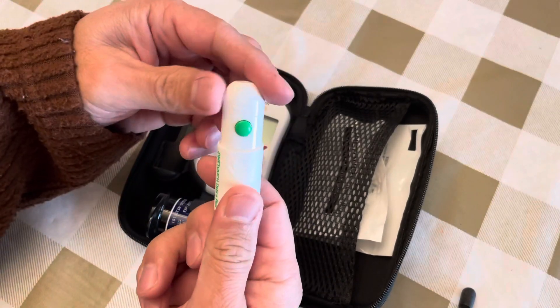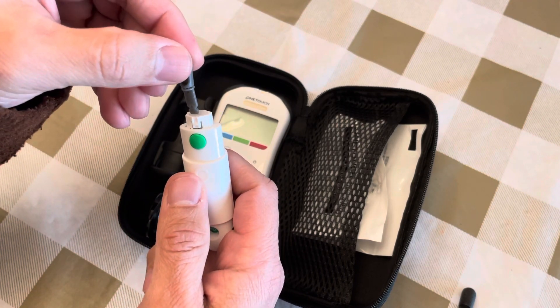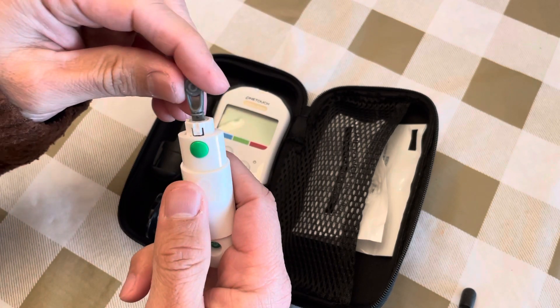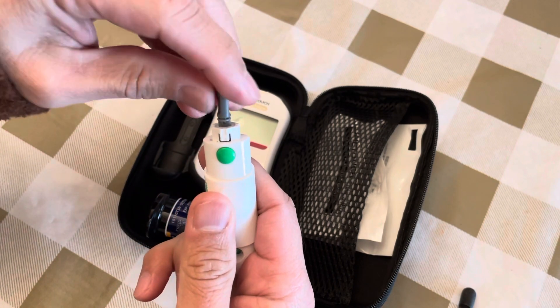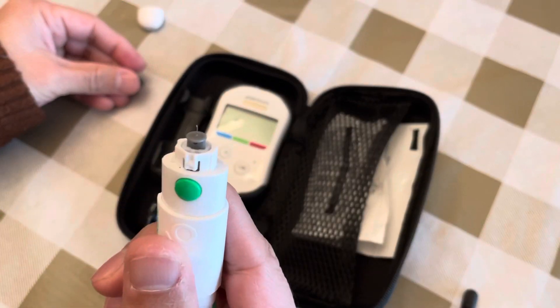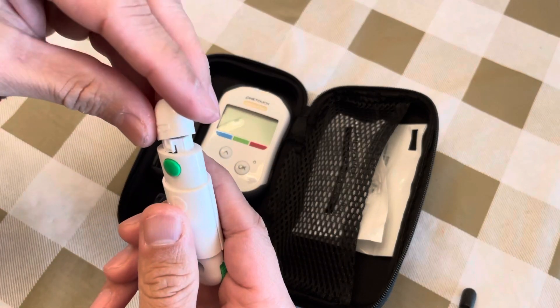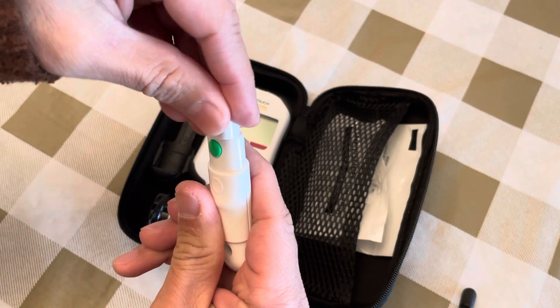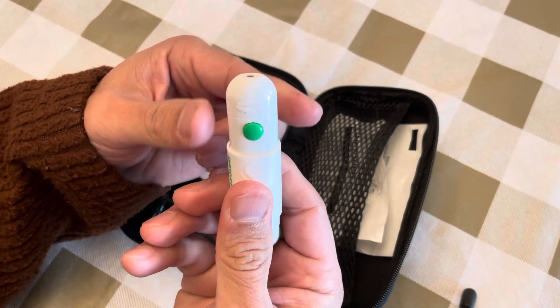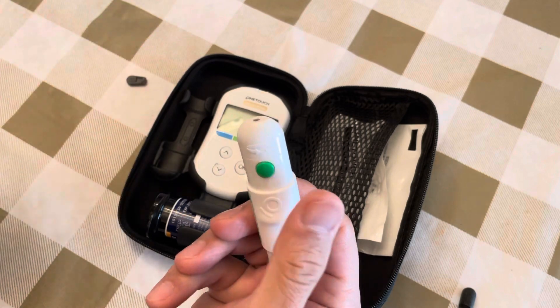First, open the lancing device counterclockwise and put the pin in here — it doesn't matter which way, it's the same. Once it clicks, it's done. Then twist it back and forth and the needle comes out. Put the cap back on at an angle, move it back, and then pull the trigger back so it's loaded and ready.